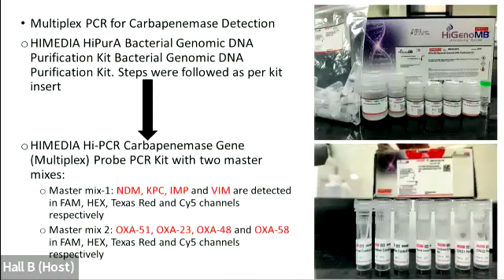Then if it was positive for both of these categories, we proceeded with the multiplex PCR. We used the high pure bacterial genomic DNA extraction kit, followed by the carbapenemase multiplex real-time PCR kit. In this kit, there were 2 master mixes which focused on the various carbapenemases which are available.